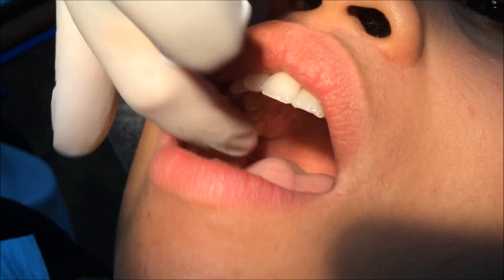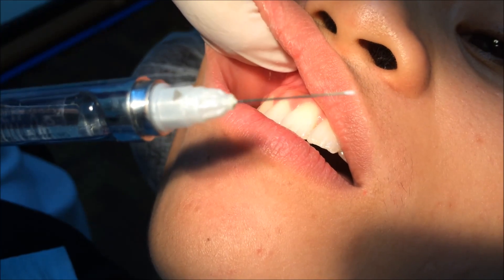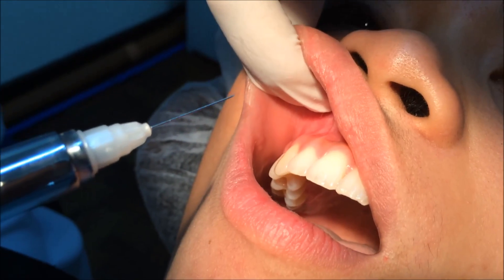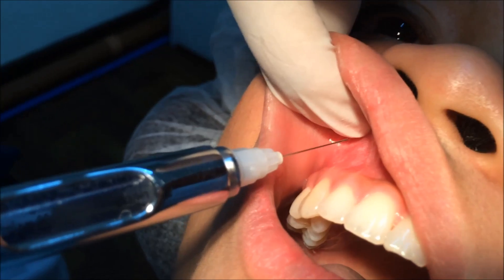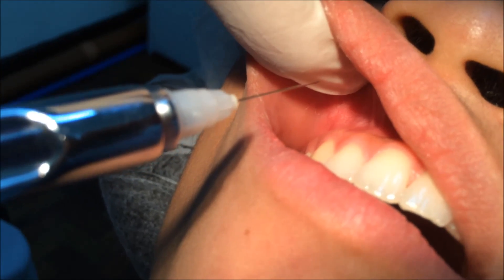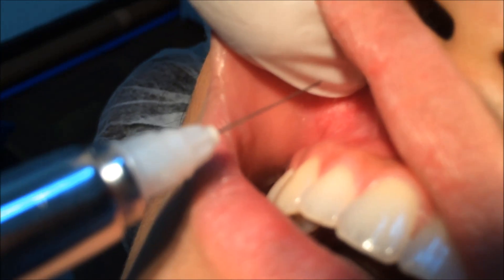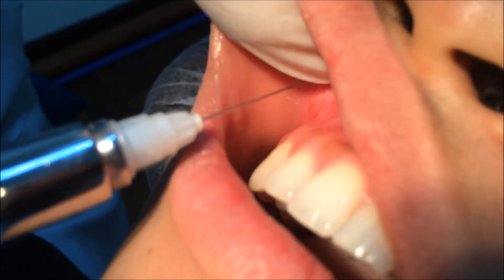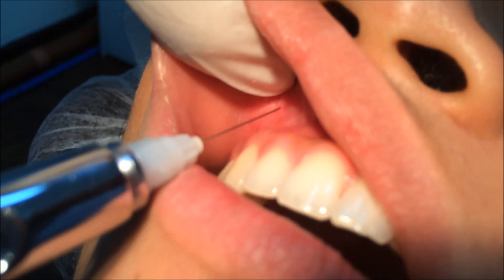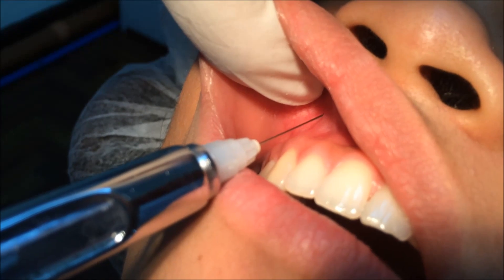Orient the needle so the bevel faces the bone. A black marker indicates where the bevel is located for easier identification. Orient the needle with the bevel facing the bone. Lift the lip, pulling the tissue taut. Hold the syringe parallel to the long axis of the tooth. Insert the 27-gauge short needle into the height of the mucobuccal fold over the target tooth, advancing the needle until the bevel is at or above the apical region of the tooth.